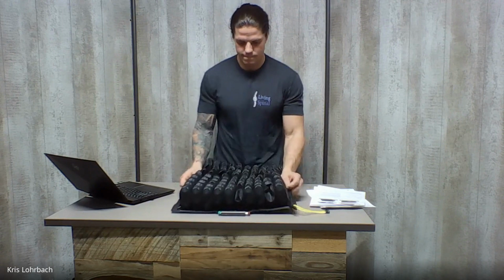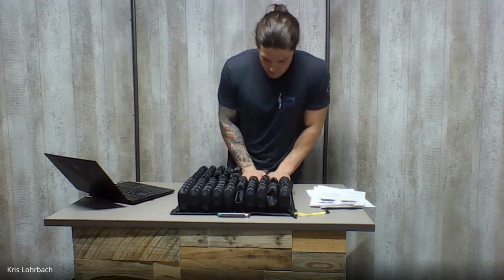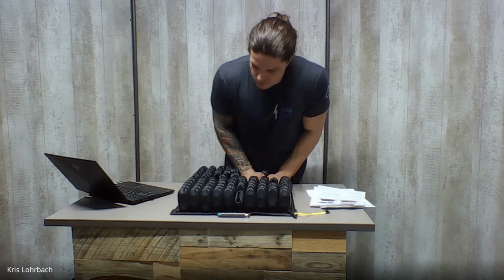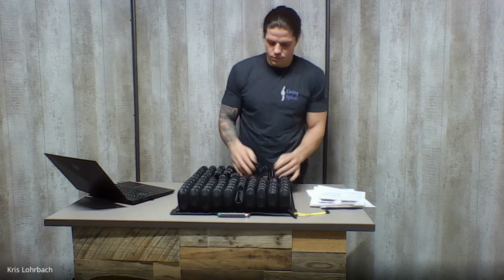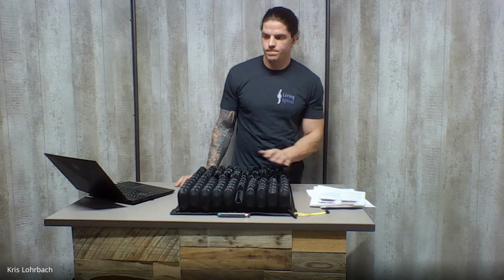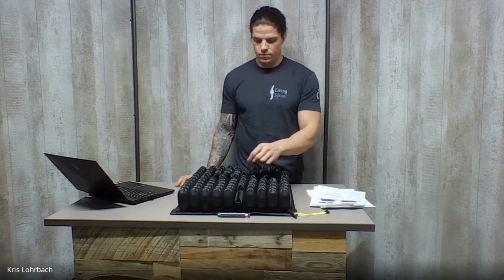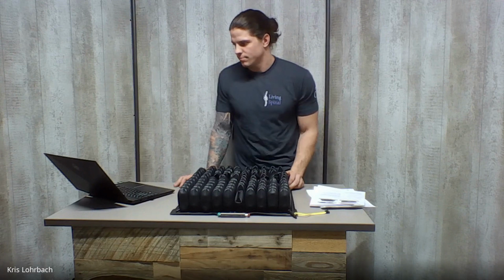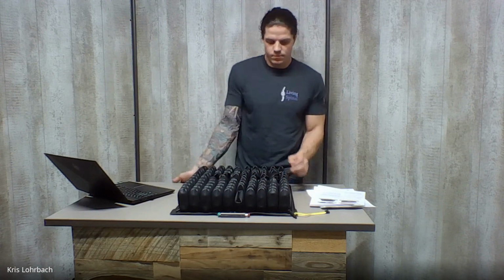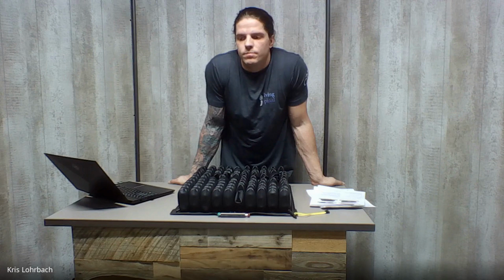Why that's neat is, for instance, in my car, I get in my car and I push it to green. I sit comfortably where I want to be, like where the posture is, and in the back it's a little bit lower. Then I go ahead and lock it and push it to red. Now, if I lean forward, the air can't flow into the back. Because if you just leave it on green, when you lean forward, the front cells are going to sink and the back cells are going to inflate and almost kind of push you out of your chair. So with this, you can lock and it almost creates a custom contour within itself, able to lock each cell with different amounts of air in them.